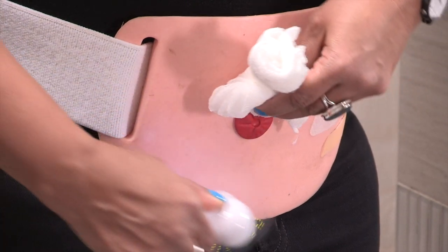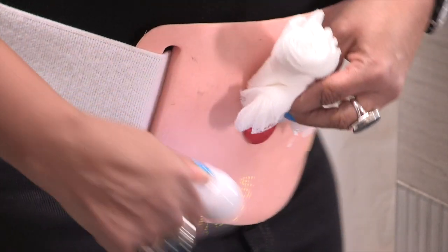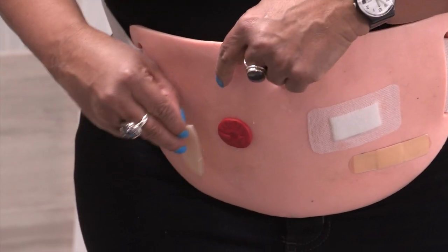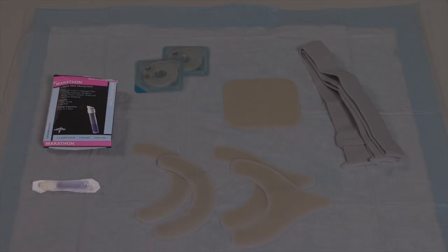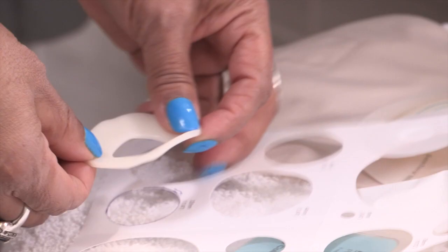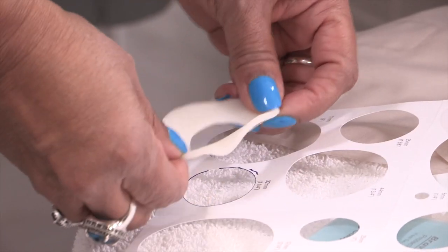Once your skin is completely dry, you're ready to put on the new pouching system. Put it on while you're sitting or standing, not lying flat. If the skin under the wafer is irritated, apply a thin hydrocolloid protective sheet or liquid skin protectant. If you're using a thin barrier ring, peel the backing from both sides. Stretch the barrier ring to fit over your stoma and gently press it onto your skin.